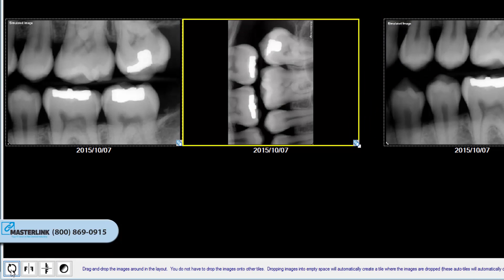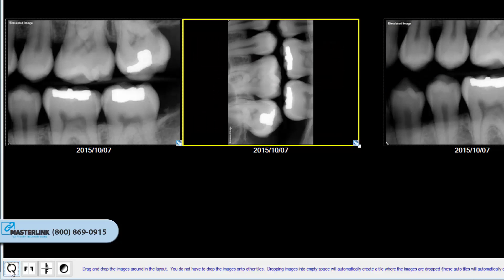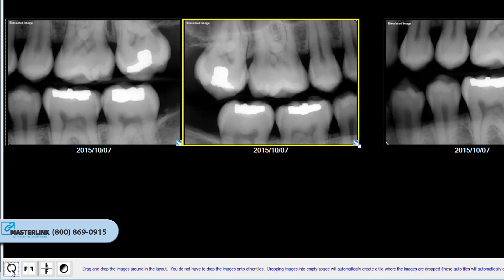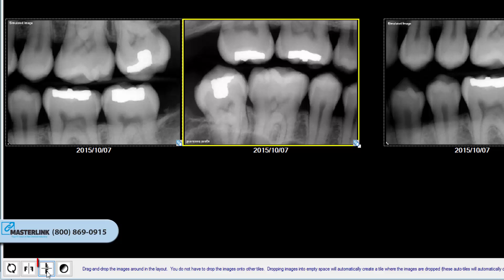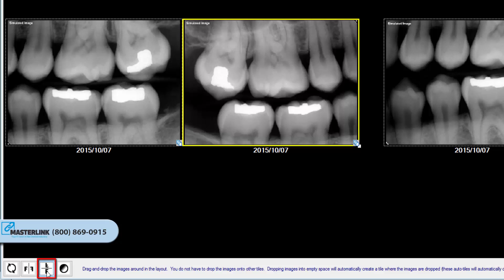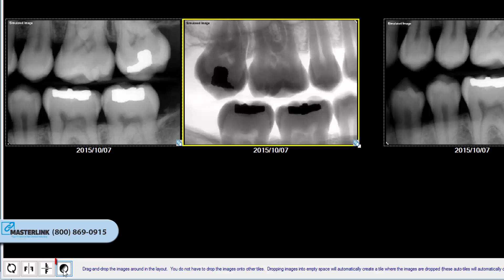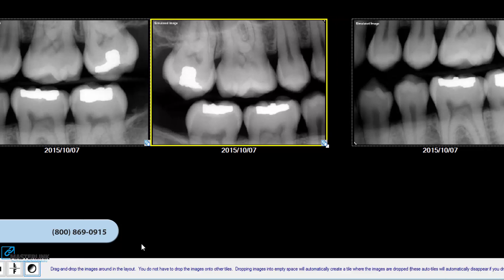The Rotate Clockwise button rotates the selected image 90 degrees clockwise. The Flip Horizontal button flips the selected image horizontally. The Flip Vertical button flips the selected image vertically. And the Invert button converts black areas of the image to white and vice versa.